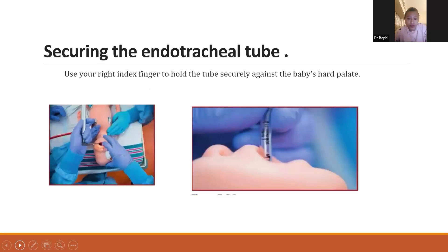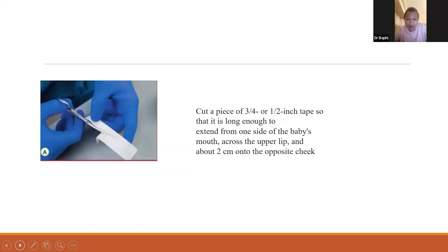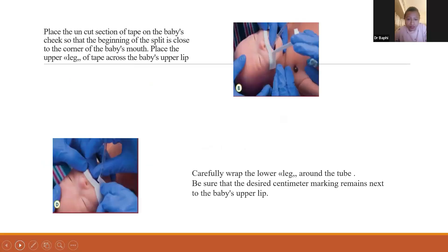Now we come to securing the endotracheal tube. We use the right index finger to hold the tube securely against the baby's hard palate. Then cut a piece of tape — 3/4- or 1/2-inch — long enough to extend from one side of the baby's mouth across the upper lip and about 2 cm onto the opposite cheek. Place the uncut section on the cheek so the split begins near the corner of the mouth, then place the upper leg across the upper lip and carefully wrap the lower leg around the tube. Ensure the desired cm marking remains at the baby's upper lip.